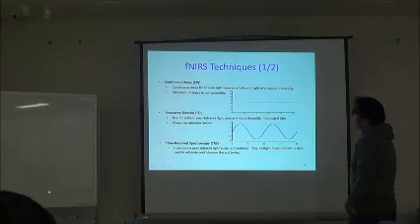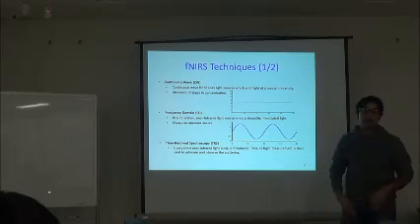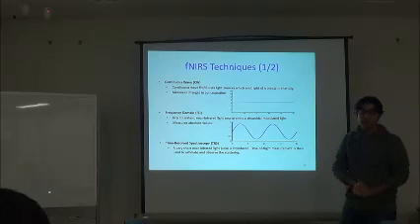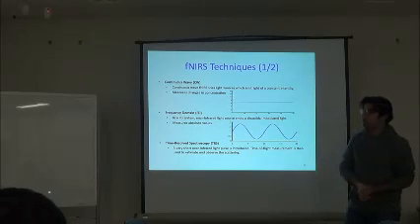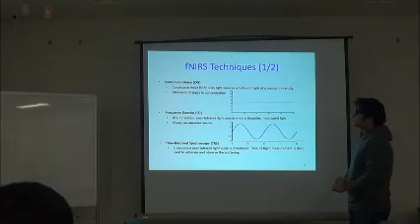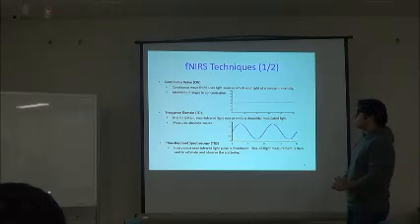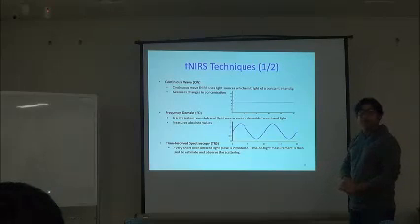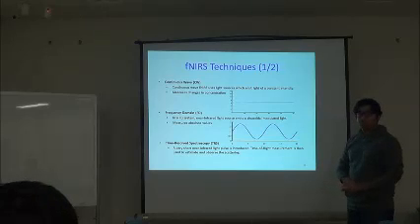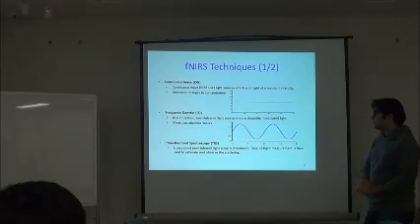Okay, now the functional near-infrared spectroscopy can be used in three well-known different ways. There is a fourth one as well. I will not touch it here. So the three techniques of fNIRS measurement are: number one is the continuous wave measurement, number two is the frequency domain measurement, and at last it's the time resolved spectroscopy, or we also call it TRS. Well, what are the differences between the three?